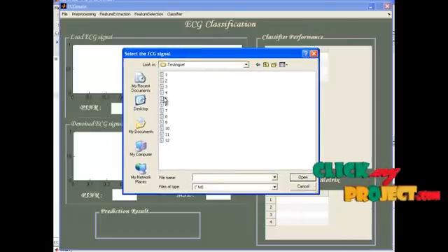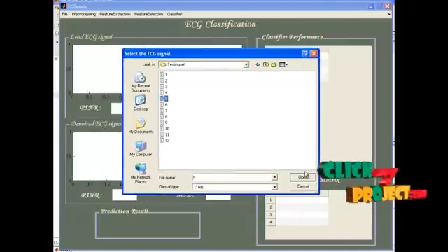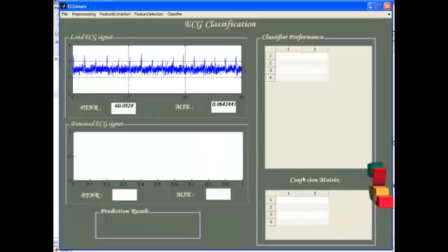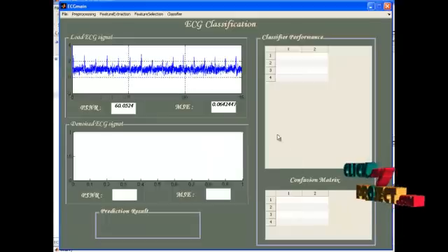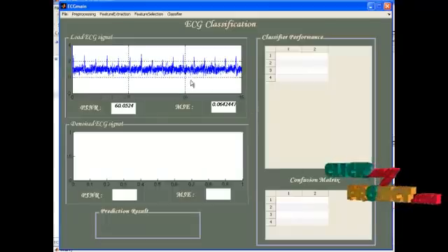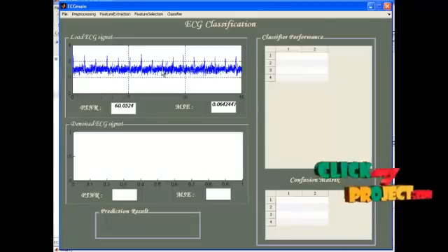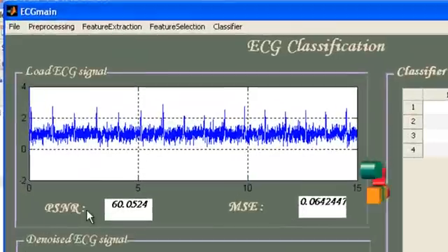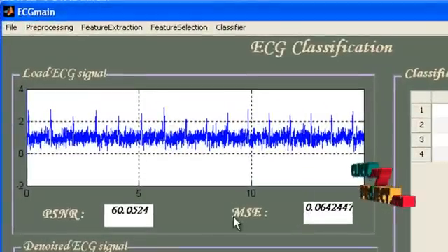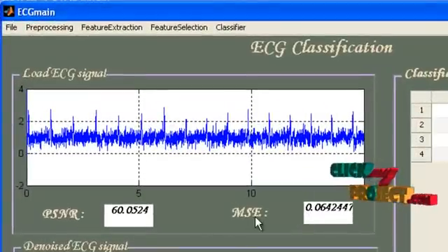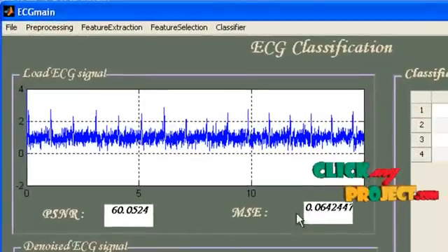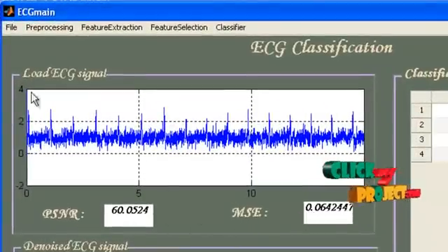A file dialog window will be shown to you for the selection of testing signal. I am going to select the fifth one. The signal will be loaded and displayed in this axis control. Correspondingly, the PSNR and MSE messages will be displayed in the text boxes.